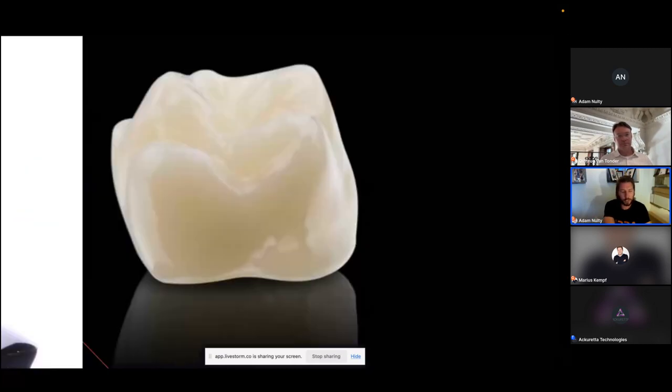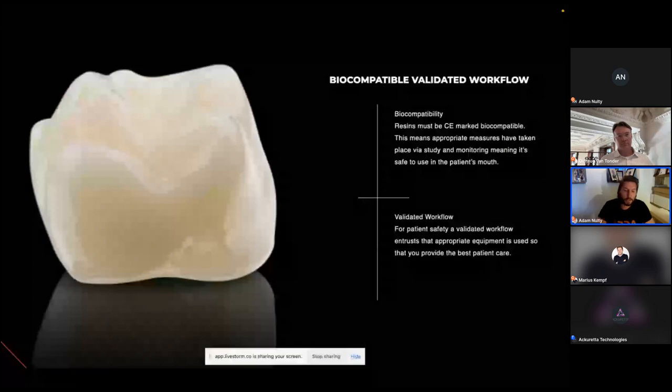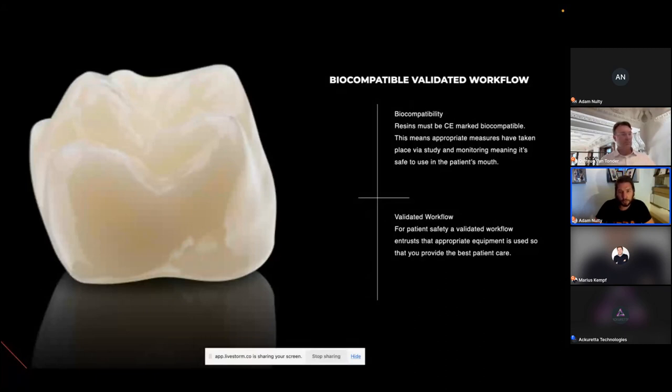So we need to treat it with respect and use it appropriately. But that doesn't mean necessarily that it isn't good, and it doesn't mean necessarily that we can't have it as part of our armamentarium to deliver restorations to the patient. It needs to be biocompatible, and it needs to have a validated workflow. So what do those two things mean? Well, biocompatibility: it needs to be CE marked. It needs to have gone through the correct testing processes, which will be slightly different depending on where you are in the world, whether it's the European directives, UK MDR, or the FDA in the US. All of these different regulations make sure that things are tested well and that it's subject to rigorous protocols in terms of patient safety.